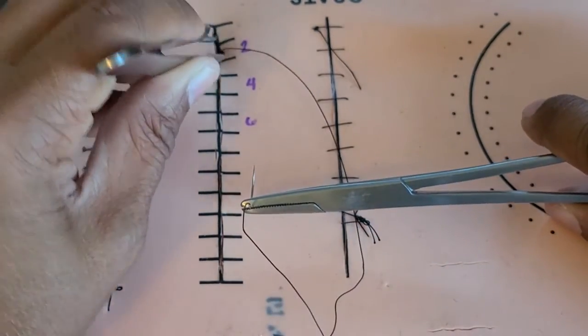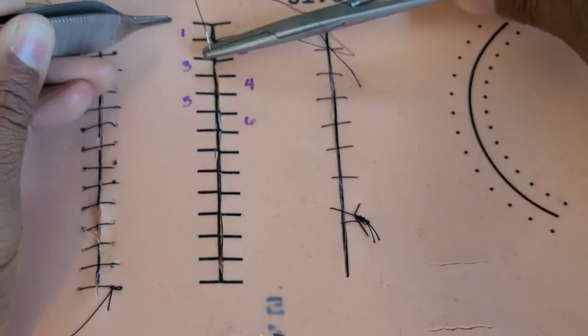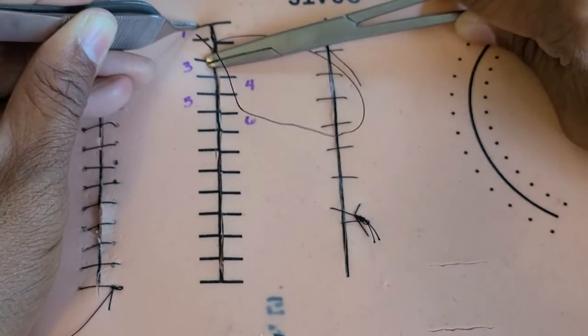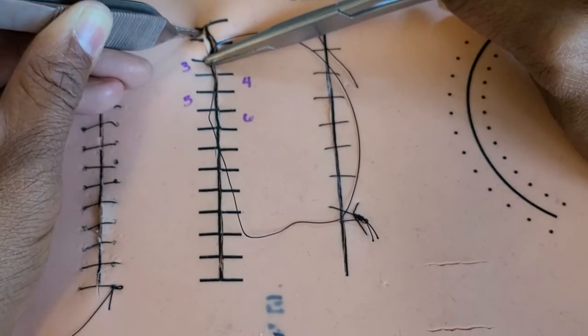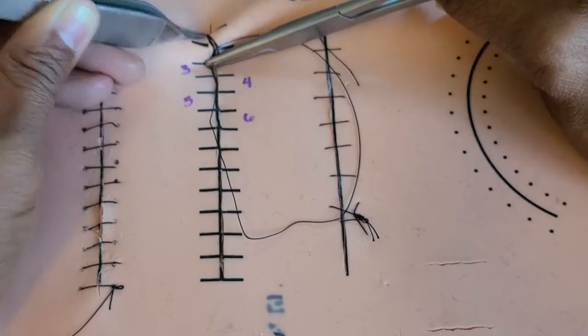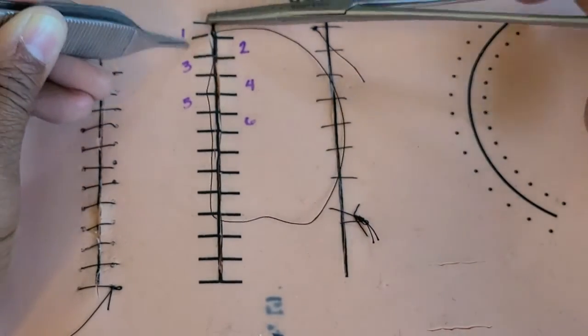You backhand your needle from the point where you ended your incision, and you aim for the very apex of the incision, which again is the beginning or tip.